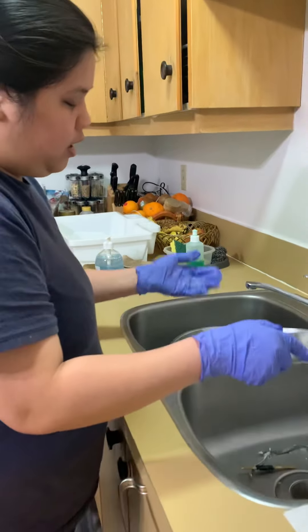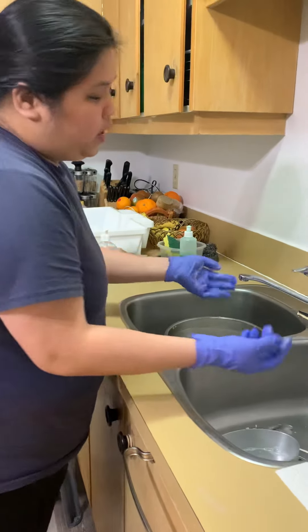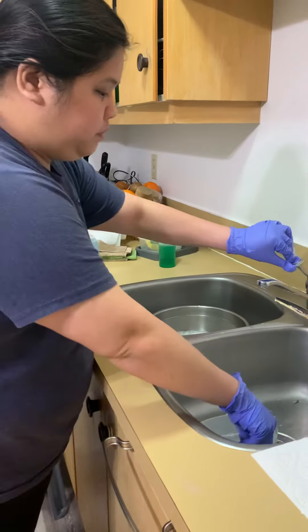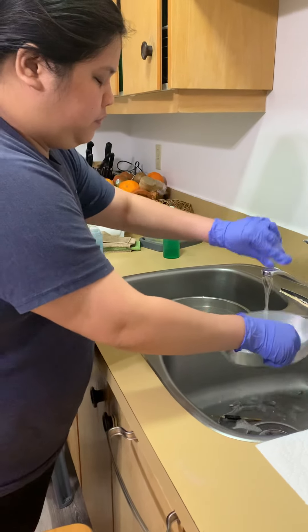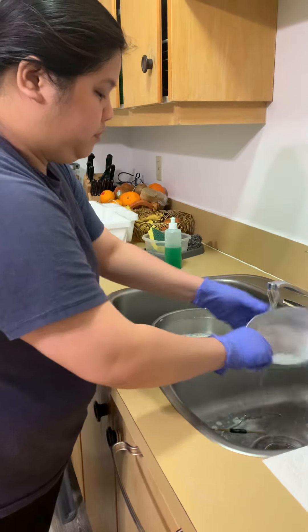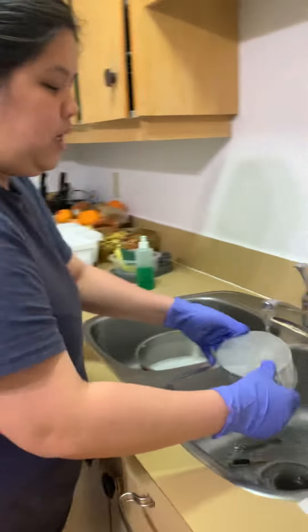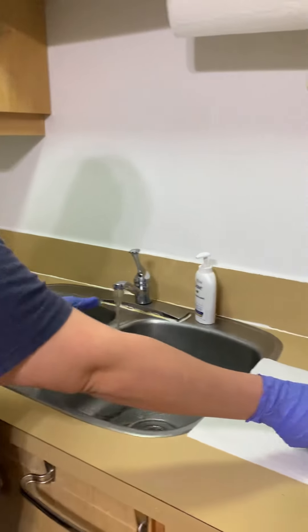After cleaning it with the actual liquid soap and brush, we're going to rinse it with clean water. And then we can put it here on a paper towel to pat-dry it.